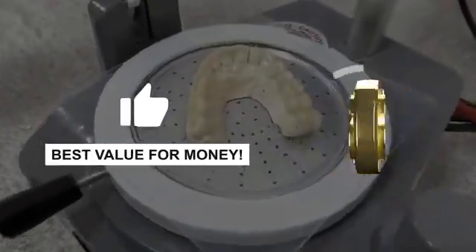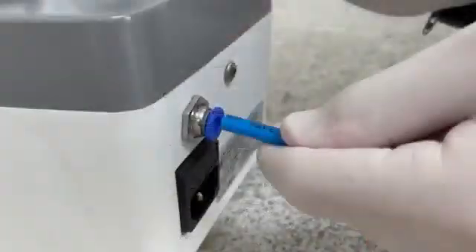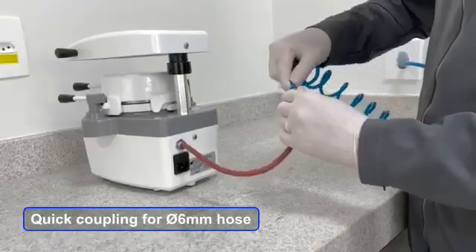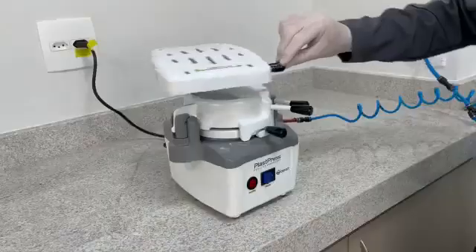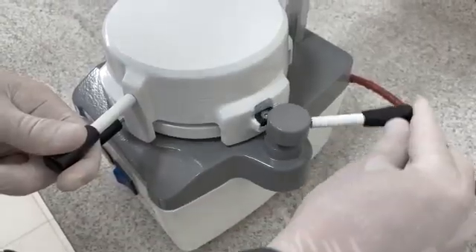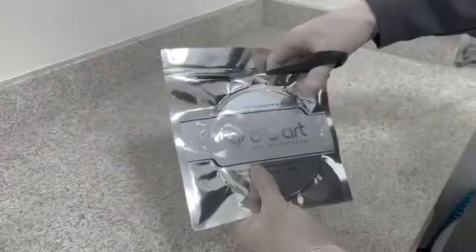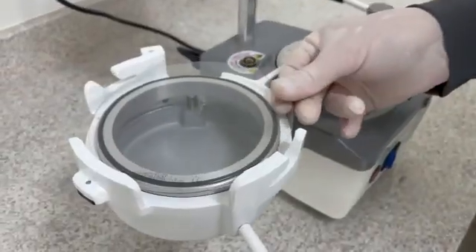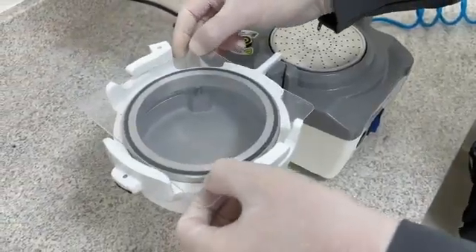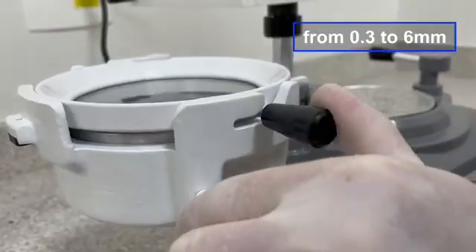The most cost-benefit pressure machine on the market. Simple installation and easy operation. Compatible with different types of sheets, for round and square shapes, rigid and flexible, from 0.3 to 6 millimeters.